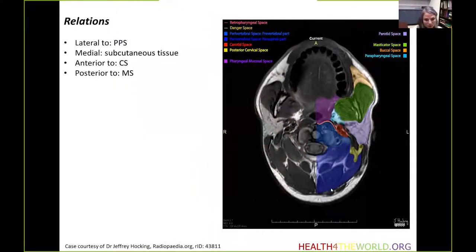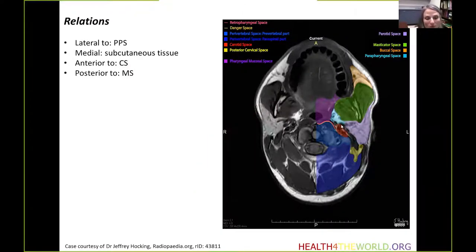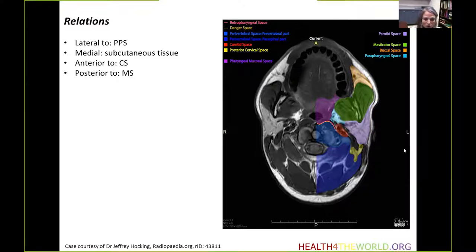The borders of the parotid space are quite wide. Anteriorly it has the masticator space as a neighbor. Somewhat medially it shares a margin with the parapharyngeal fat or parapharyngeal space. Posteriorly there is the posterior cervical space.